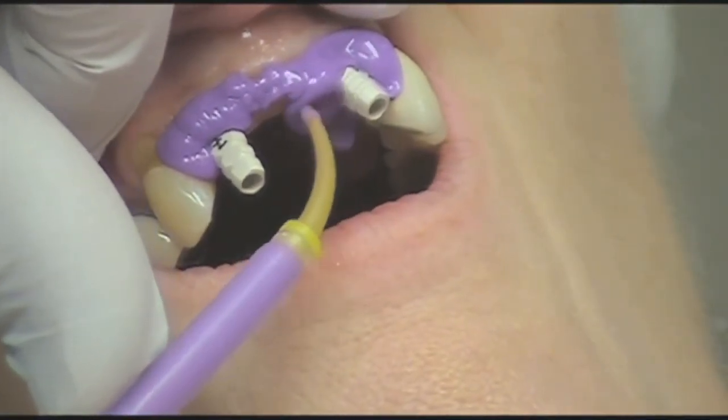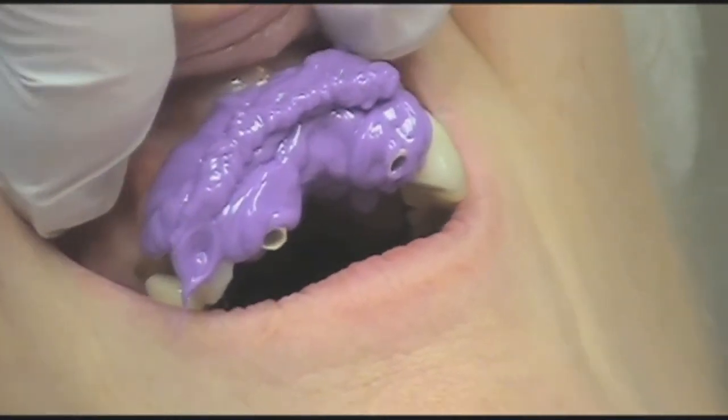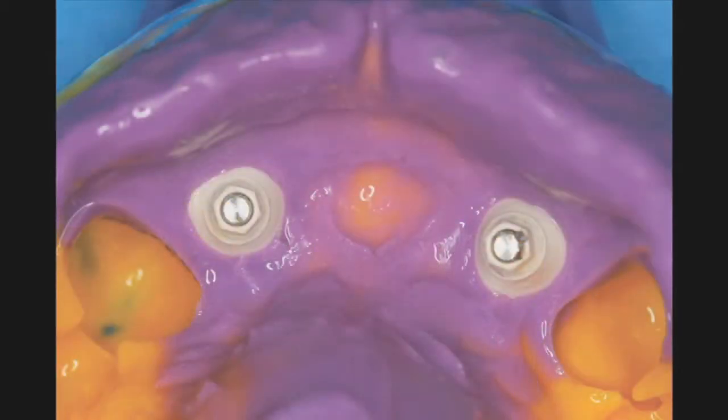All of this is done prior to any surgical intervention. An impression can be made, and the laboratory can certainly start contemplating what the final prosthesis will be. The impression is made crisp and clean using polysiloxane materials, and the impression copings are then removed and snapped into the impression for the laboratory to fabricate a master cast.